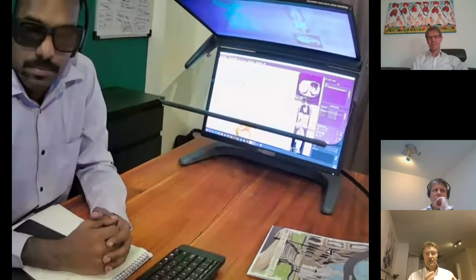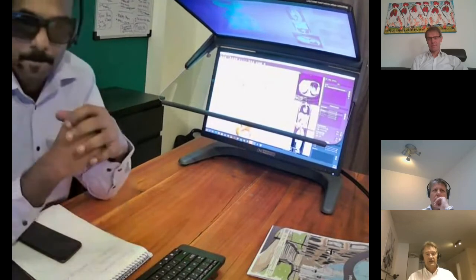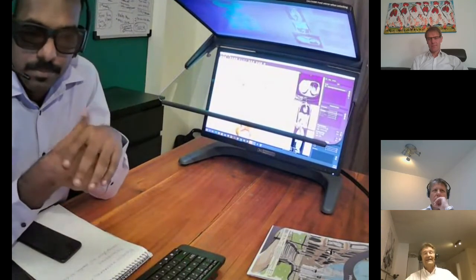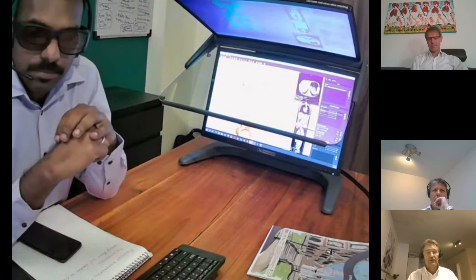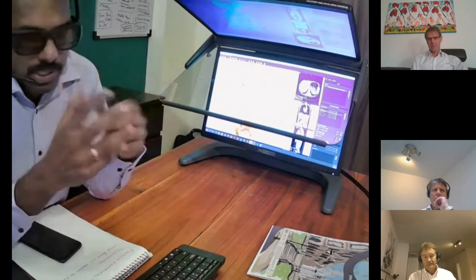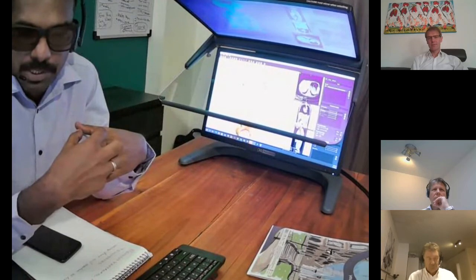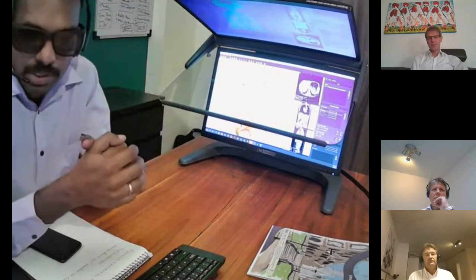And that's the combination. I'm not saying that 3D printing is not valuable. It is very valuable. But the combination of Vesalius 3D with 3D printing, especially in a PluriView VR, is very, very powerful. You have the best of both worlds. One more thing is that you don't have to wait for the 3D printed parts to come back after printing. You can still interact with your model.